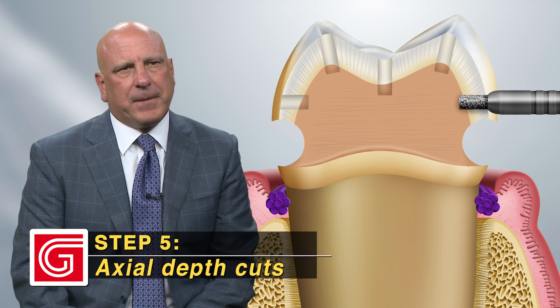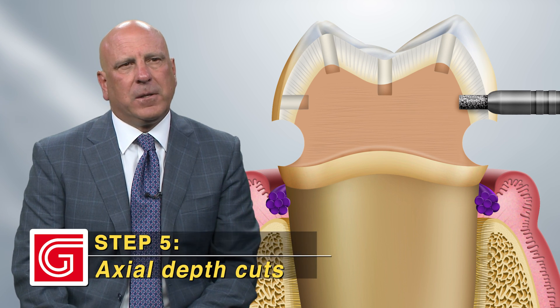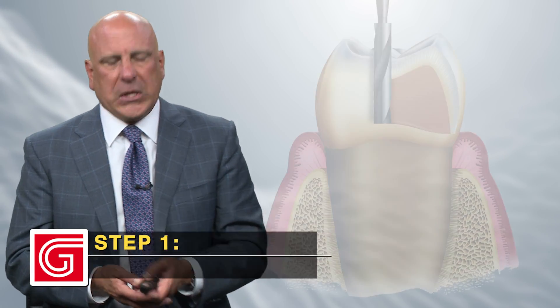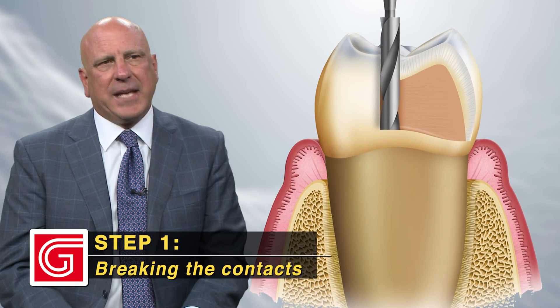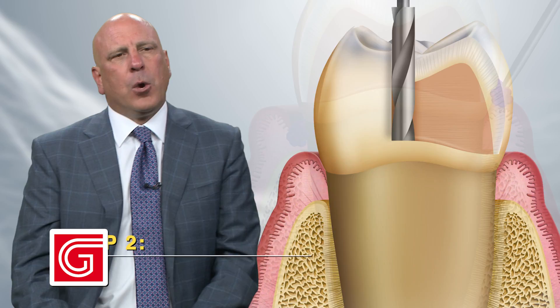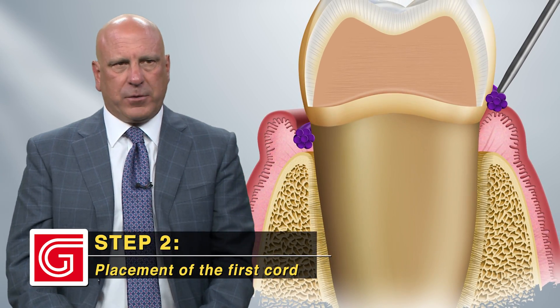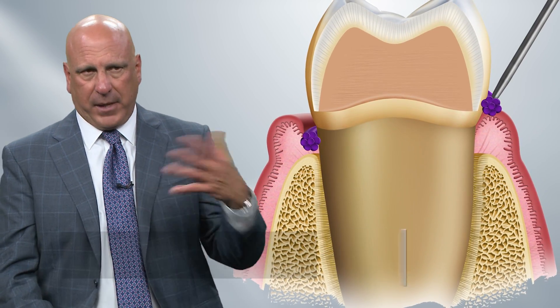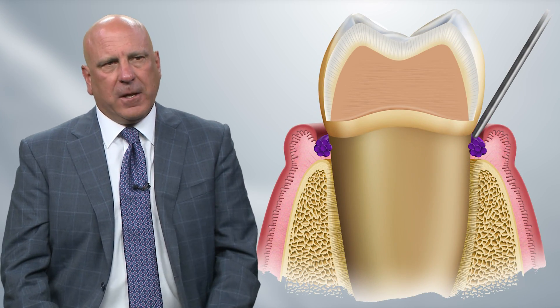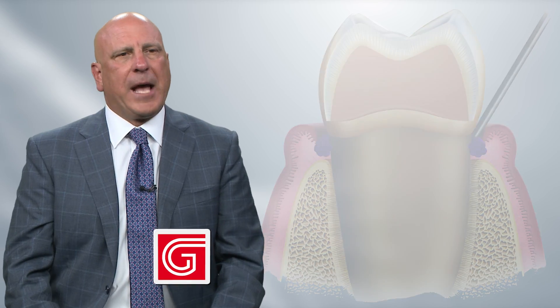We need our axial depth cuts at the height of contour on the buccal and the lingual. Once we're done with that, we're ready to go. The steps on a posterior tooth: we're going to break the contacts on the mesial and the distal with our #56 carbide burr. We're going to place a double-zero retraction cord — a plain cord, not soaked in anything — and cut the two ends flush so we don't have any overlap.